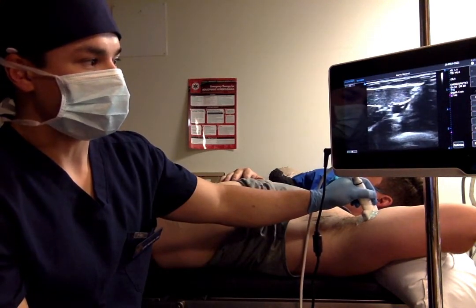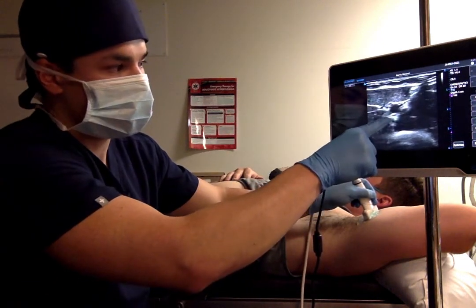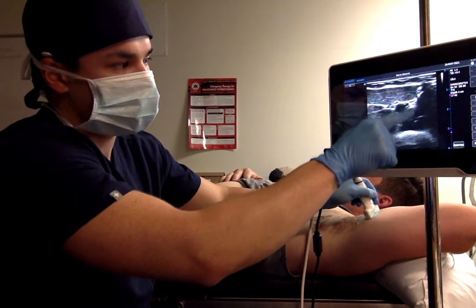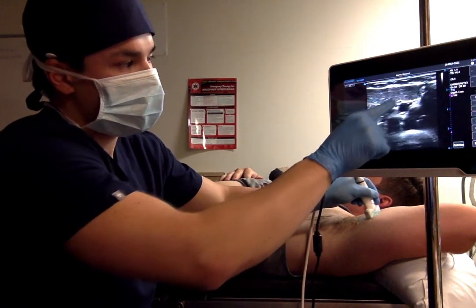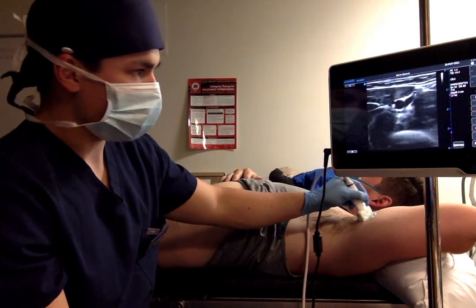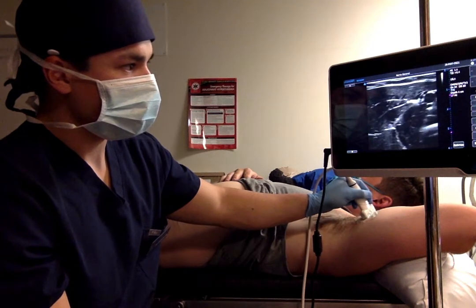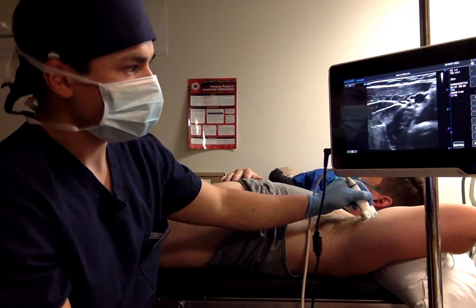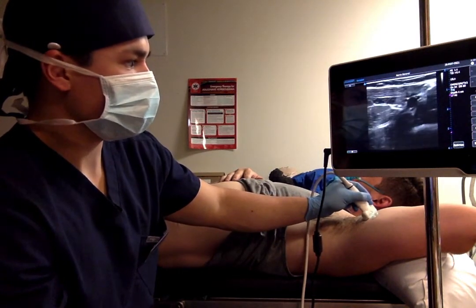And then in a counterclockwise direction, we have the radial nerve, to the ulnar nerve medially or laterally, and then superiorly we have the median nerve. And then we're going to look and scan proximally on the patient to look for the musculocutaneous nerve, which is coursing through the coracobrachialis muscle.